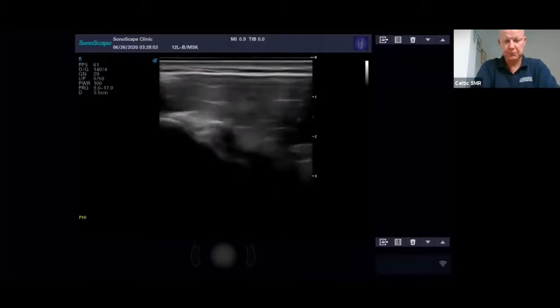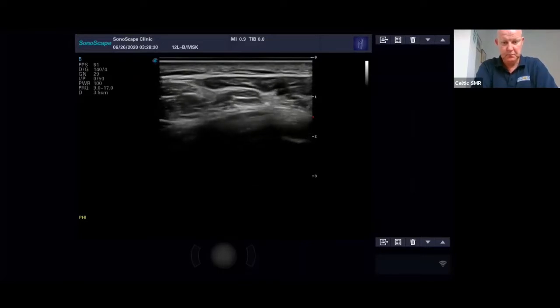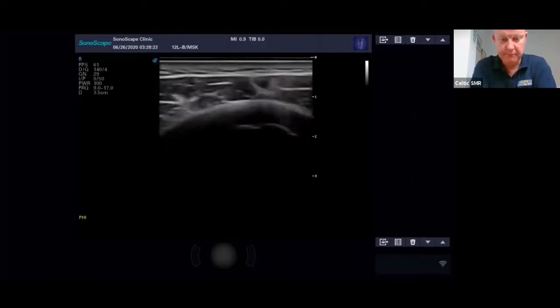It's a slightly different position. So, Abid, with your left hand, if you can pop that across onto the other side, this has the effect of stretching out the tendon. My glasses keep steaming up. I can't see the screen. There we go.